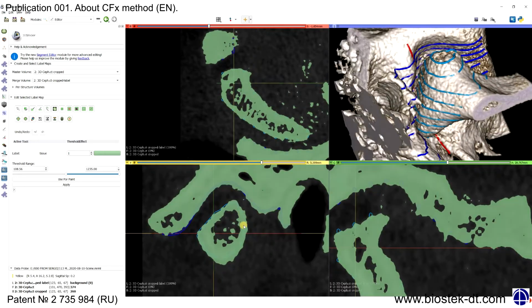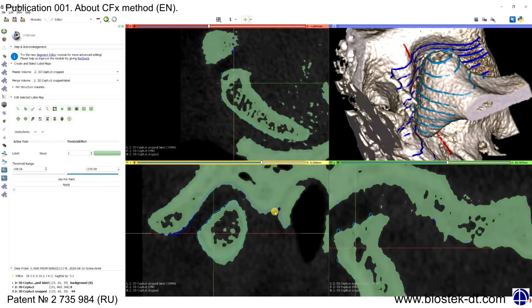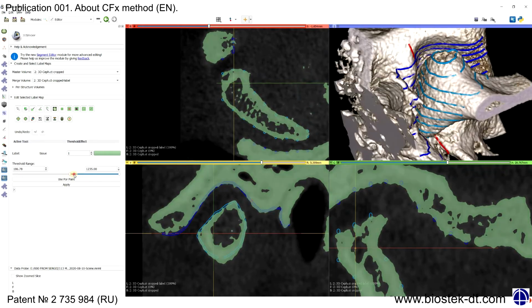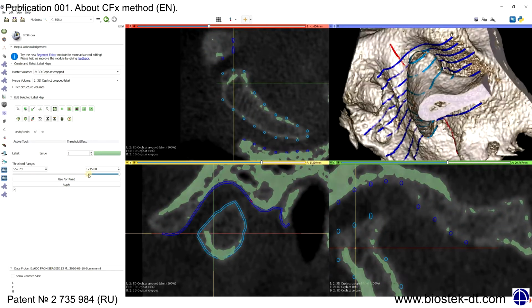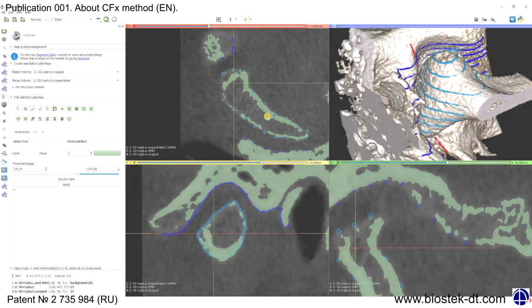The data that is obvious to the doctor and interpreted as a joint space, border of a condyle or border of articular fossa on a particular slice, is not caught by auto-segmentation systems. The precision of contouring of objects comes down to a large enough error of 1 mm or more, which inevitably leads to a significant distortion of volumes and inaccuracy in constructing the layout of 3D models of TMJ.